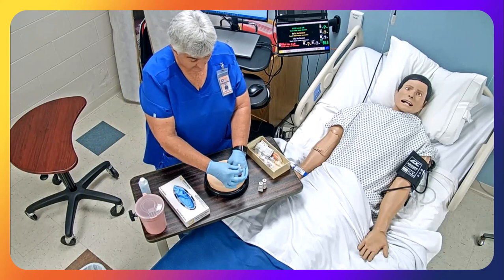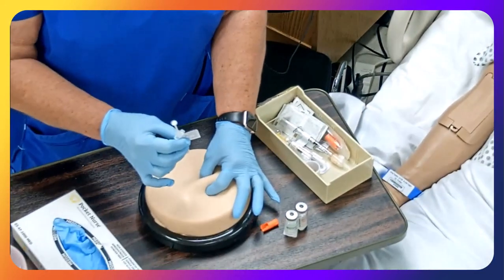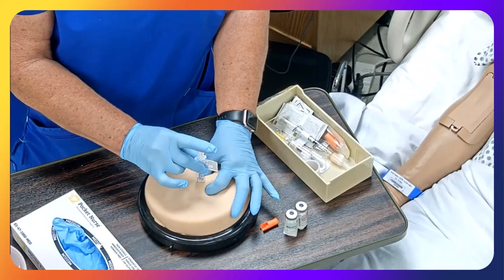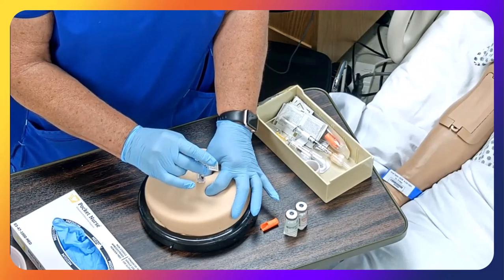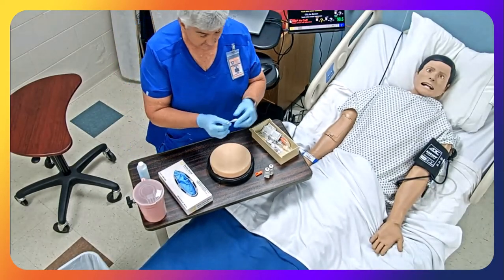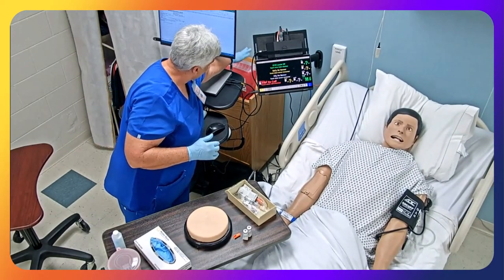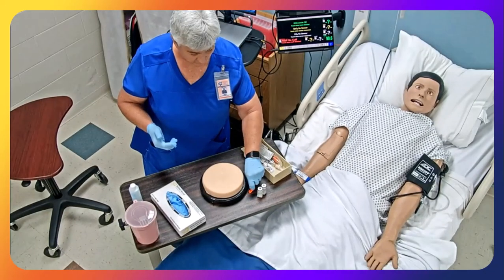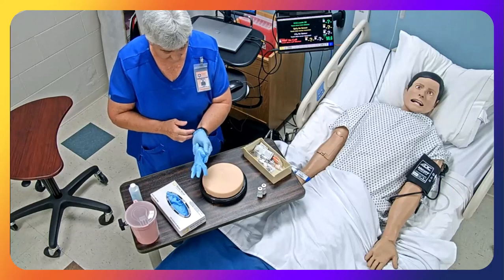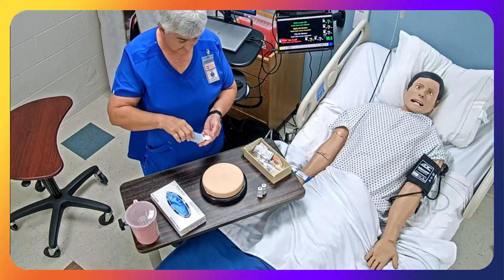Okay. I'm going to pull this out. Okay. We want to keep the pinch the whole time. Okay. A quick darting motion. 1, 2, 3. We're going to go ahead and give. We're going to go ahead and take out. We're going to go ahead and deploy our safety device on there, and then we're going to go straight to the sharps container, okay? And I don't want to rub, and just making sure that it's not bleeding, okay? Typically they don't, okay? And so took my gloves off.